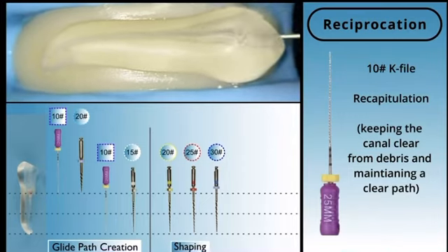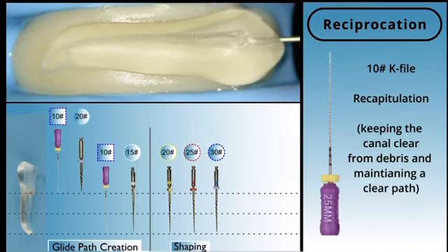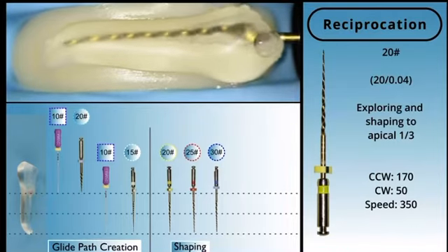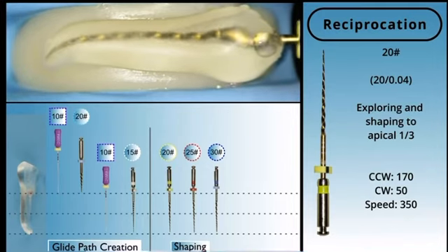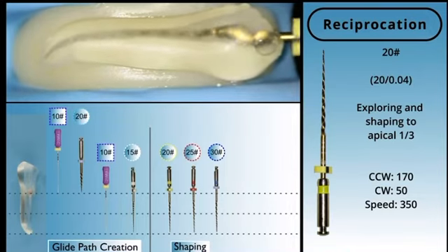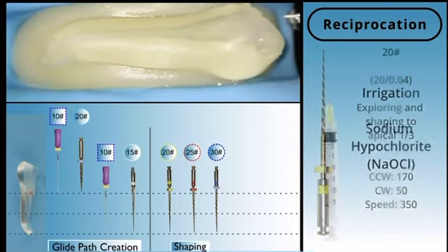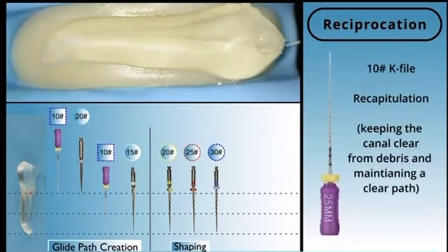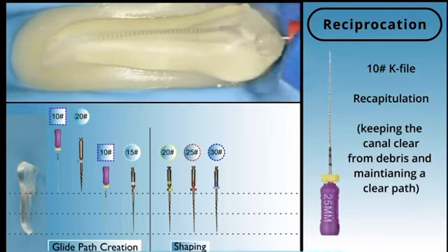Again, this is me really struggling to remove the debris from the apical third. More irrigation. And back to using the size 20 finishing file. Again, slightly struggling to remove the debris.